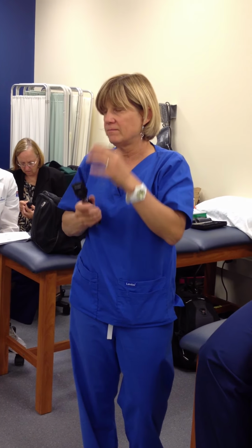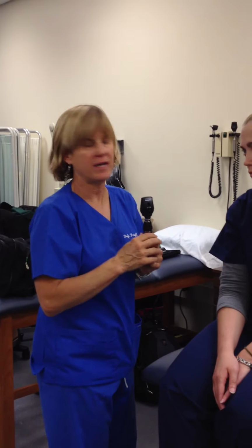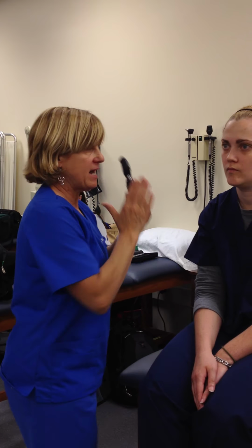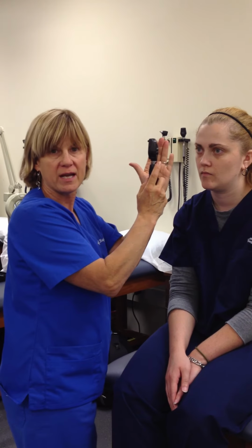Before they actually look in the light, do you want them to look kind of at your ear? Yeah, you want an angle, look over my shoulder, okay? So if we say look at the wall, kind of look over my shoulder, and then I'm going to kind of come in with these traditional ones at about a 45-degree angle.